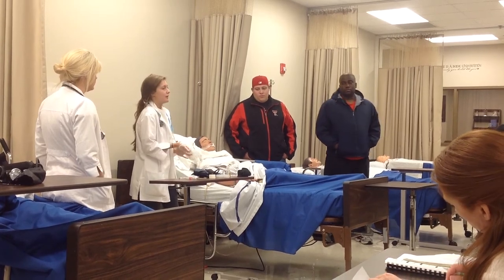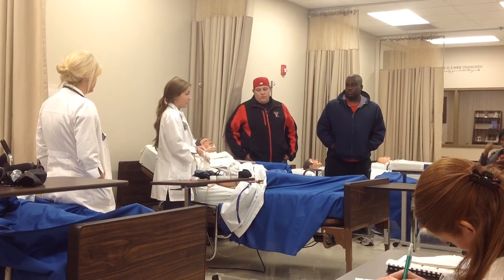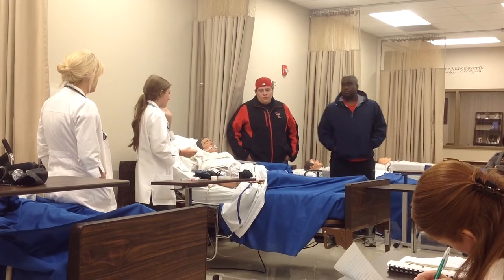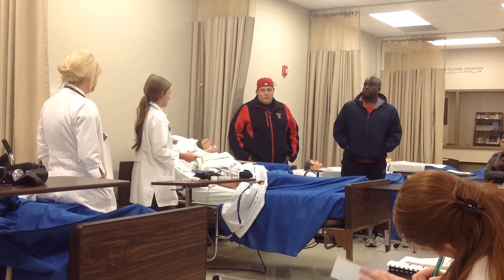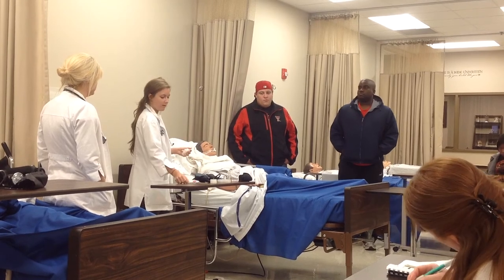What you want to document is their skin integrity and their state when you walked in the room. Then you're going to insert the oral airway, and you need to document their respiratory status and their vitals at that point. Then you're going to document the suction, the respiratory status and vitals after you suction, and that's all. And that you did some oral care on them.